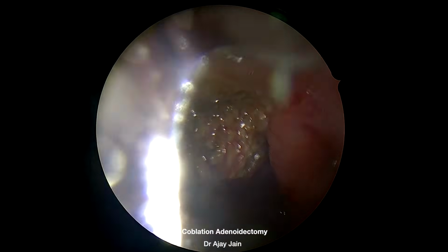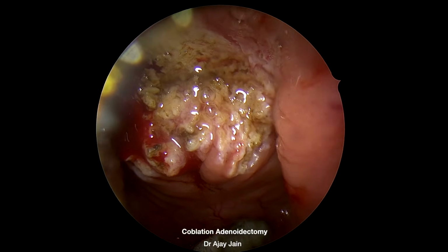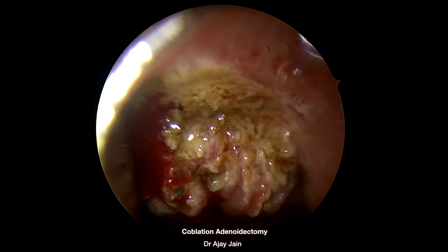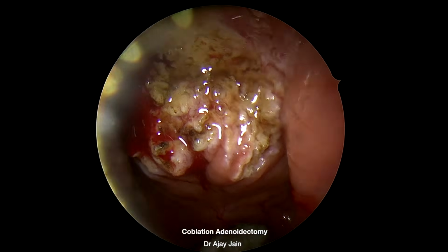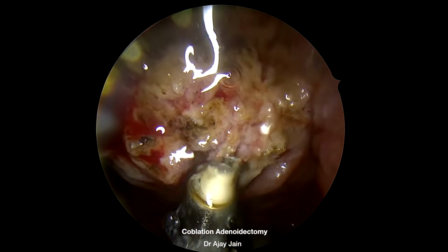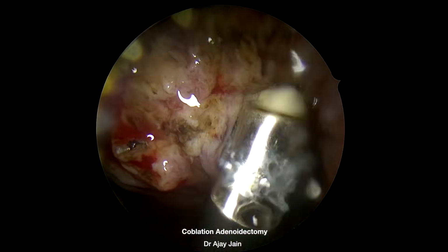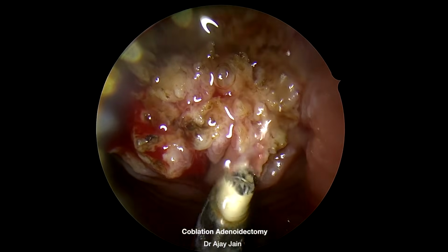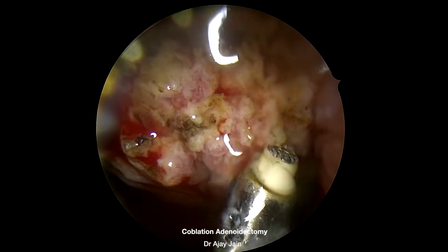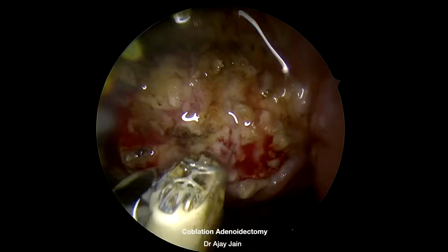These are gently ablated while preserving the posterior tubal cushion and surrounding structures. One important surgical lesson is to avoid becoming excessively perfectionist, especially when the child is above the age of 7 years. In a younger child, they can recur, but chances of recurrence in a 13-year-old female are very less. So I don't want to be a perfectionist here. Chasing microscopic remnants may be unnecessary and it opens up new bleeding points. Once the airway is adequately cleared and hemostasis is complete, it is wiser to stop.